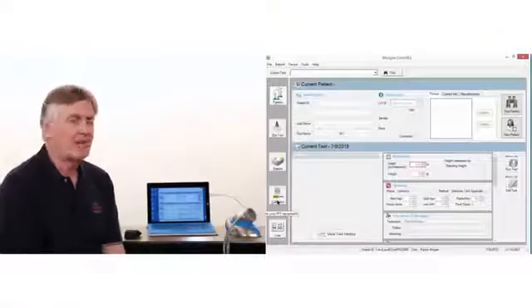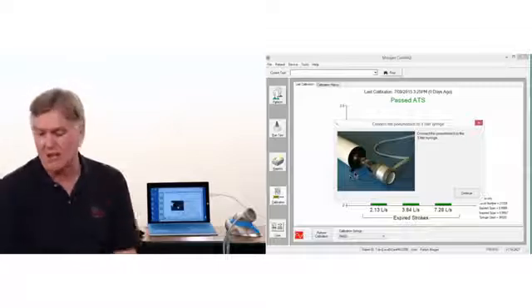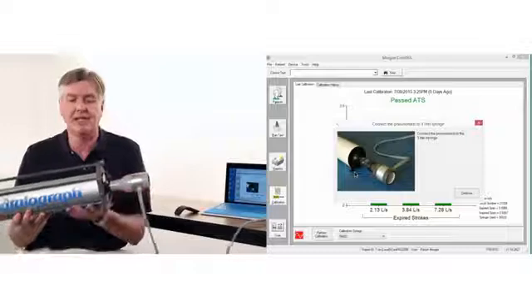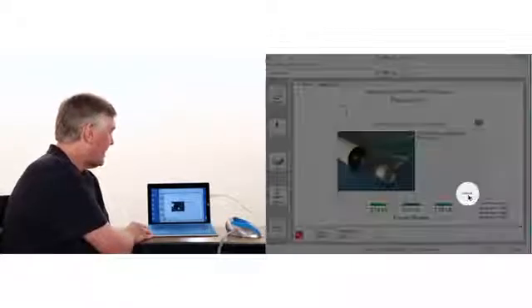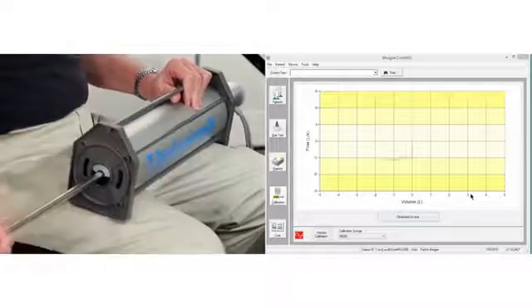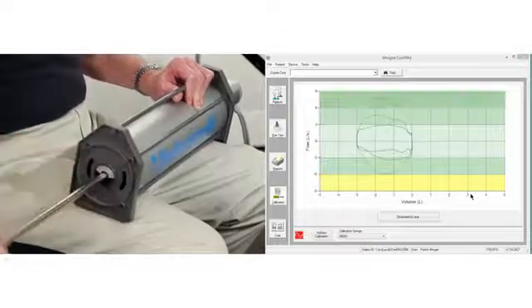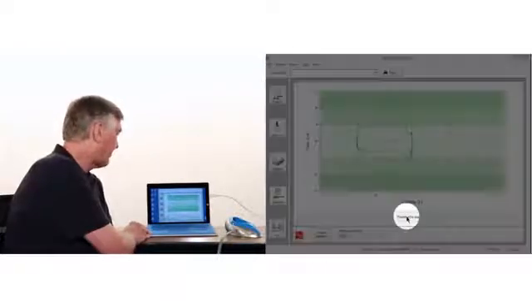To perform a quality check, we simply click on the icon and select that we want to run the quality check. And for this, we bring in a 3-liter syringe. The 3-liter syringe connects directly to the Pneumotrac. So it's a very simple and easy connection. From here, we continue on. It reads the flow zero, and we're shown a grid which simply records each 3-liter stroke at different flow rates. And as we meet each of the flow ranges, they turn green. And that confirms the quality check.